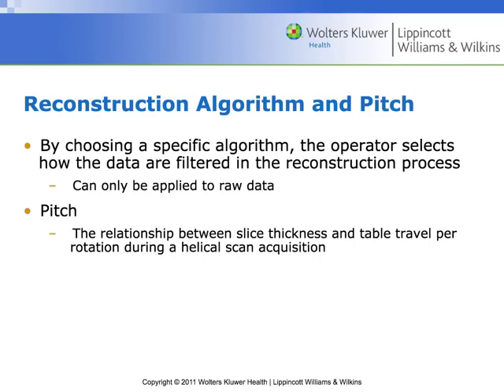Okay, so we can tie, to some degree, our reconstruction algorithm to the pitch. We discussed reconstruction last week? Is that what we talked about? No, we haven't. We're going to talk about that next week. I'm sorry. Last week we had our midterm. All right. We will get more in depth into reconstruction and reformatting next week. But just understand that the way that we reconstruct the images has a direct bearing on what the pictures look like. We can actually construct spatial resolution, increase spatial resolution into these images. Okay?